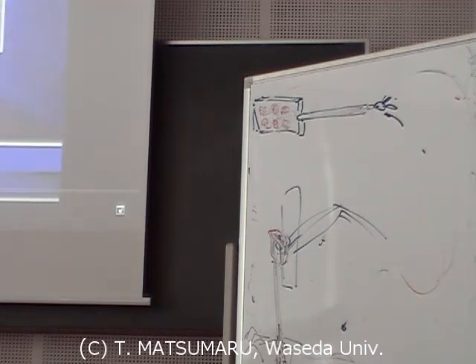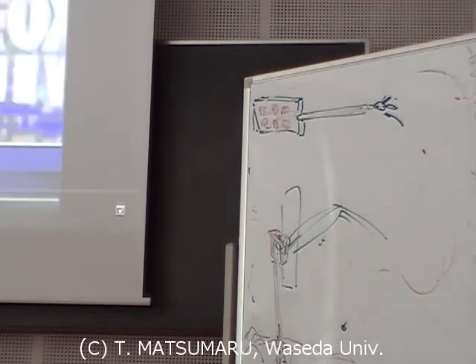So you're saying there's nothing wrong with the Da Vinci robot? There's really nothing wrong with the system itself. I've been personally using it for 12 years. A lot of other surgeons are using it, and I think there is some learning curve, and we see more and more surgeons coming in to use it, but there is a right process and right channel to really get there, and that's the learning curve. And unless you've done at least 200-300 plus, you're not going to do well, and that's why the cases are longer and they may have complications.